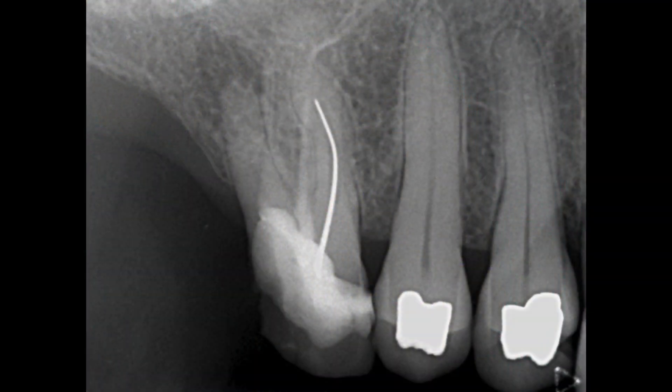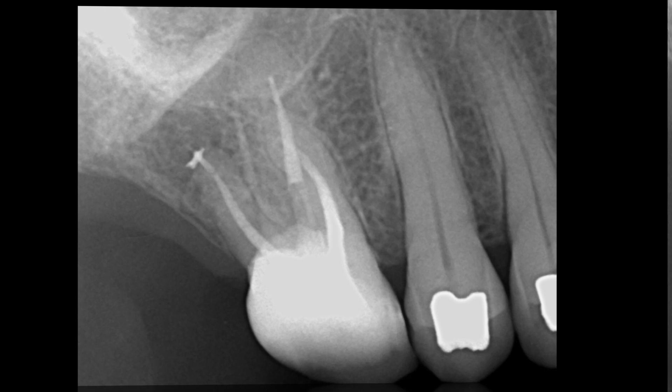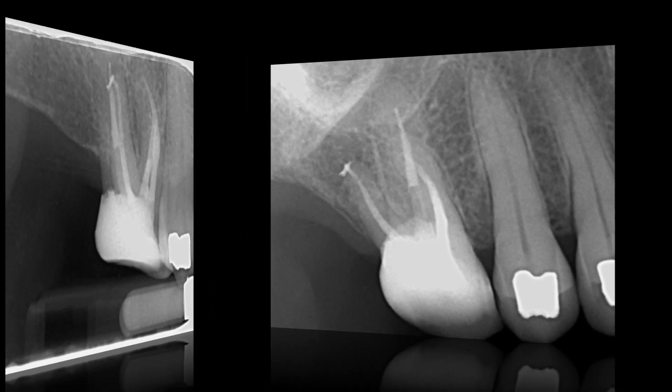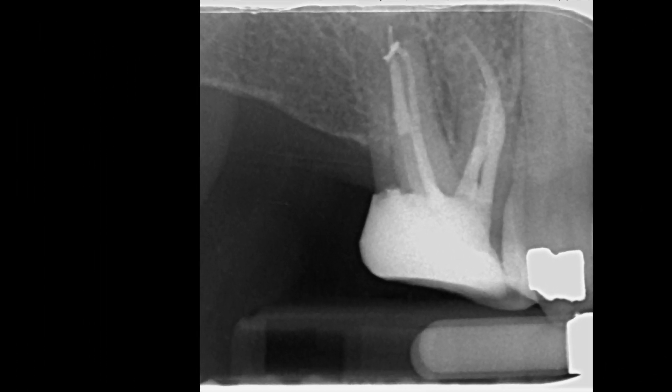Here you can see the preoperative radiograph for comparison. The post-op radiograph shows good coronal-apical seal. A distal angled view shows the confluence between the mesial canals and an interesting acute apical curvature in the distobuccal canal.